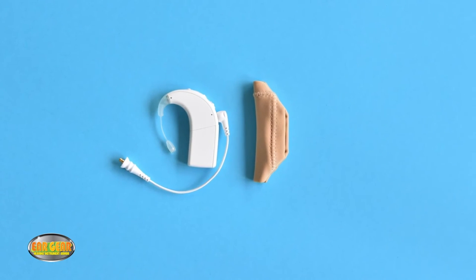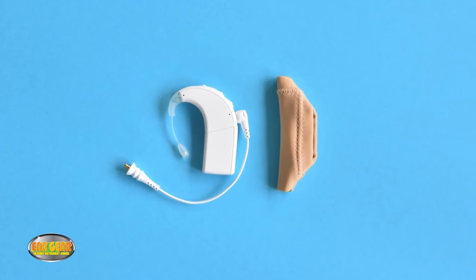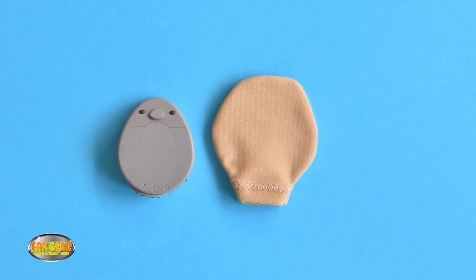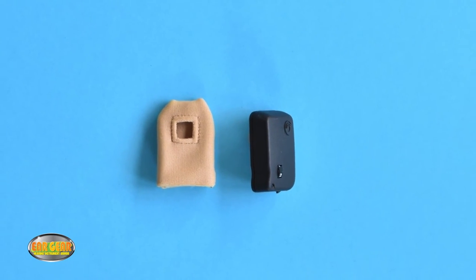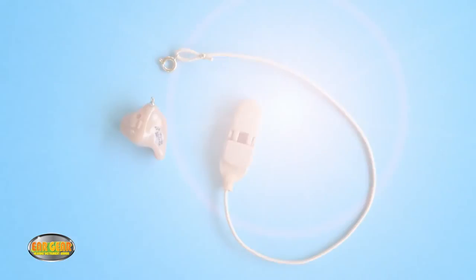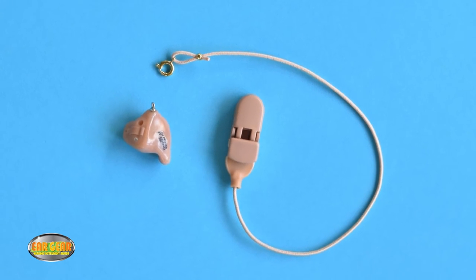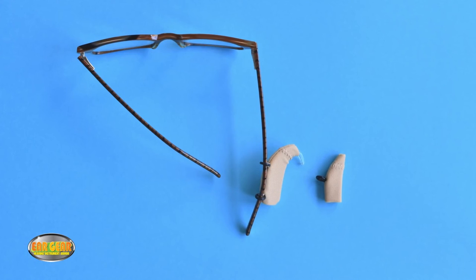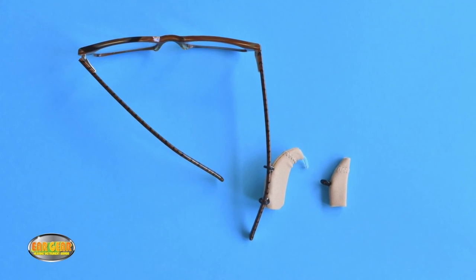Eargear Cochlear fits cochlear, Advanced Bionics, Neurolec and Medel processors. Eargear Rondo fits Rondo implants. Eargear Baja fits Baja and Ponto implants. Eargear ITE works with in-the-ear hearing aids. And Eargear Eyeglasses is designed to attach your hearing aid to your glasses.